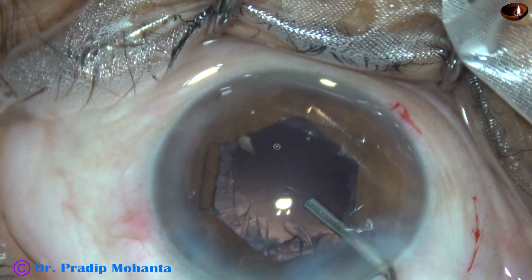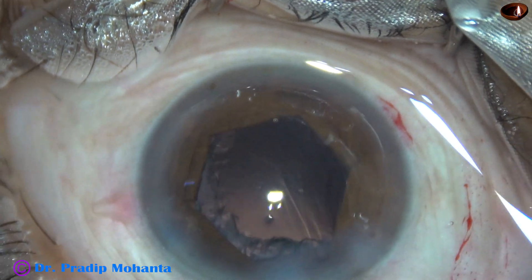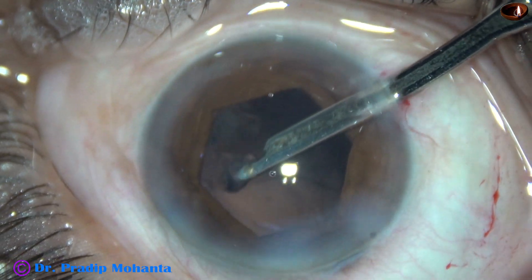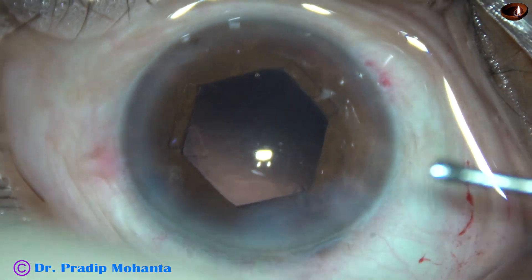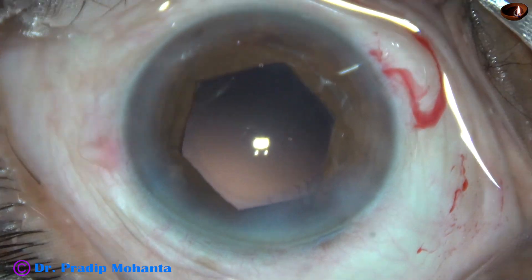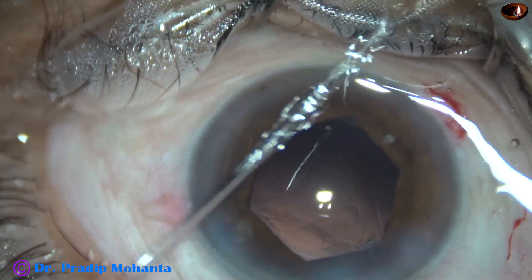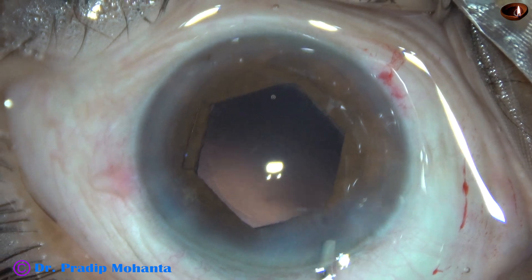Now, this is a bit of viscoelastic. You can see a very small bit of nucleus remaining — let it come out first before I start removing the cortical lens matter. I have gone through the 8 o'clock side port, removing the cortex from 11 o'clock to 4 o'clock. Then I inject some more viscoelastic and go through the main incision. This instrument is a 23G Simcoe — see how beautifully you can remove the cortical lens matter. I then go through the left side port and remove all the cortex.